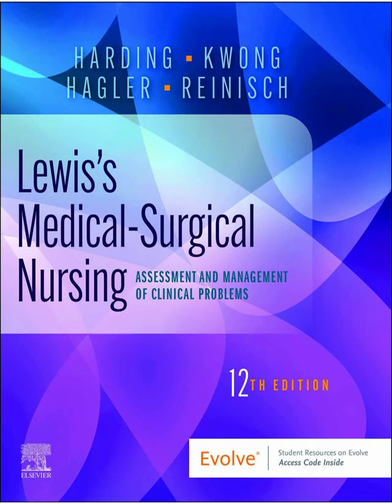Got it. What about AFib? That one seems huge. Atrial fibrillation, AFib. Yes, this one you absolutely must know inside and out. It's the most common dysrhythmia we see clinically that causes problems. You see this chaotic, irregular baseline. Those are fibrillatory F waves instead of P waves.